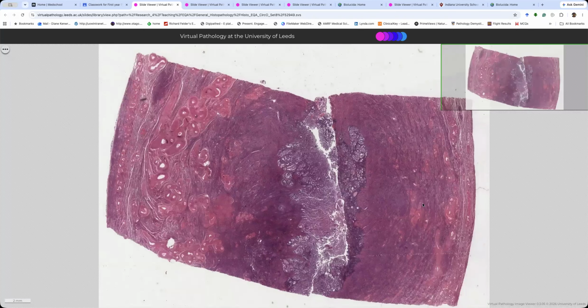All right. So this is a full thickness uterus. I'm just going to point out some anatomy here. We have this big vascular plexus in the outer half of the uterus, right? And this is kind of a cheat's way of determining whether it's in the outer half or not, because sometimes you don't get great sections, or the uterus is so full of cancer that the walls become 2 millimeters thick and it's hard to tell whether it's in the inner half or outer half. Look where the large vascular plexus is.